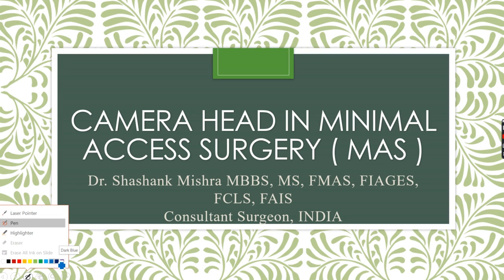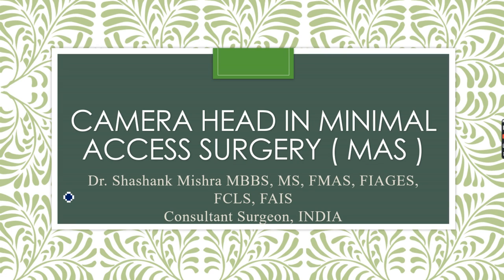Now, in this video, we are just going to discuss the basic concepts of the camera head in minimal access surgery. Just to remind you, this video is a part of the imaging system used in minimal access surgery that we are discussing. We have already discussed the telescope, followed by the light cables. And in the third video in this series, we discussed the light sources available. And this is the fourth video in this series, where we are discussing the camera.